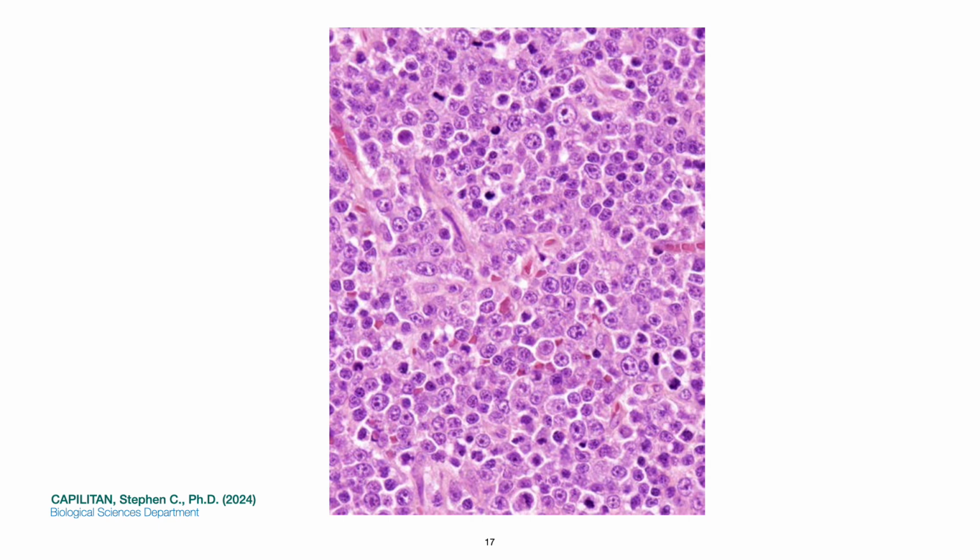Histologically, lymphomas consist of sheets of lymphoid cells that are arranged either diffusely or in a follicular pattern. This figure illustrates a diffuse large B-cell lymphoma, DLBCL, which is characterized by sheets of large atypical lymphoid cells. DLBCL is the commonest type of high-grade lymphoma.